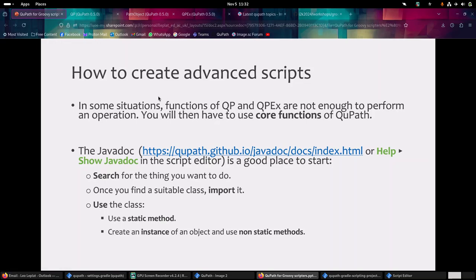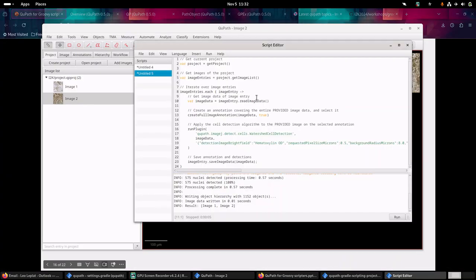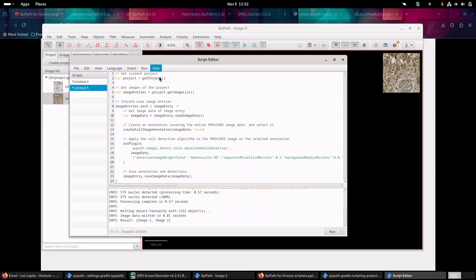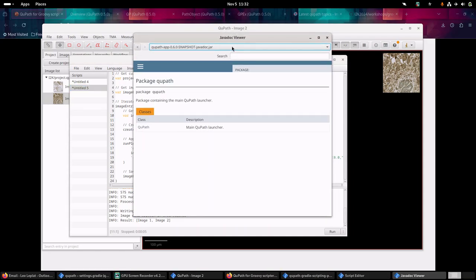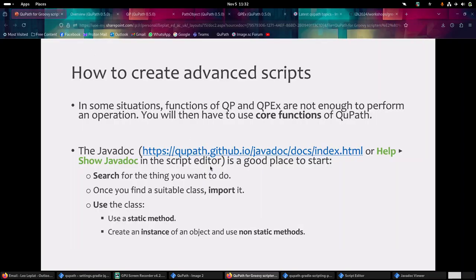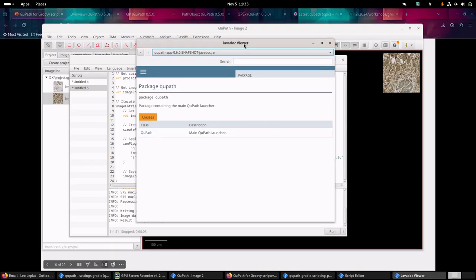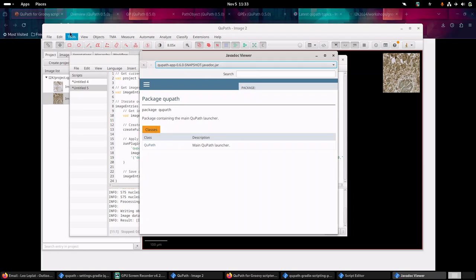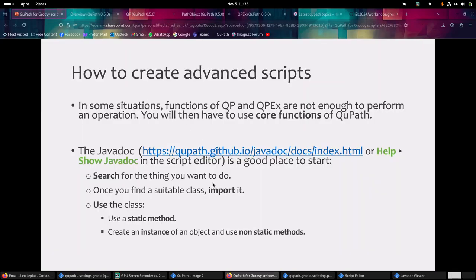In most situations, the functions of QP and QPEx will be enough to do the analysis you want to do. But sometimes it's not. If it's not, you will have to look at the Javadoc - it is available online but also available if you click on Help and Show Javadocs. How to proceed if you want to do something not covered by QP: three steps. First, you search for the thing you want to do using the Javadoc and try to find a class useful for what you want to do. Once you find it, you will have to import it. Finally, you can use it.